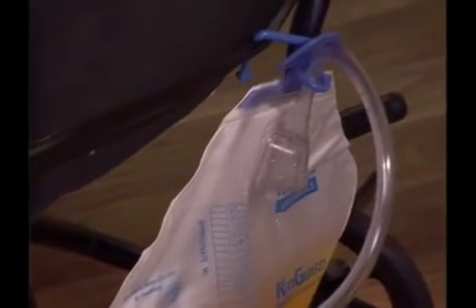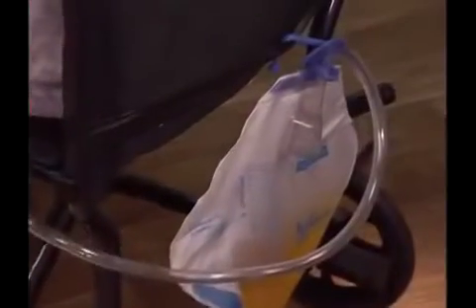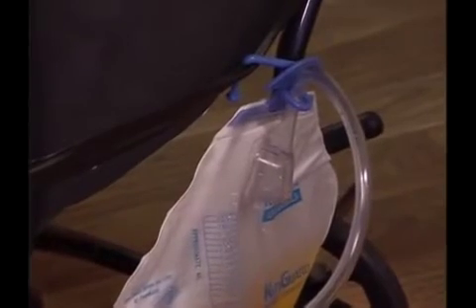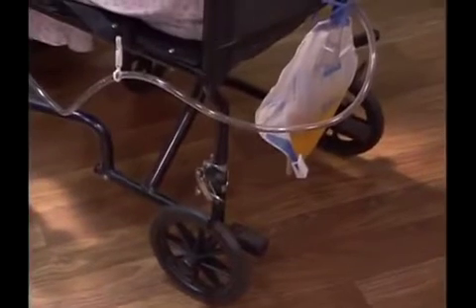This bag is just one of several types of bags. It features a long length of tubing that allows it to be carried or secured to a bed frame or the back of a wheelchair, as shown here. Note that the bag is kept away from the wheels and at a level that is lower than the person's bladder.